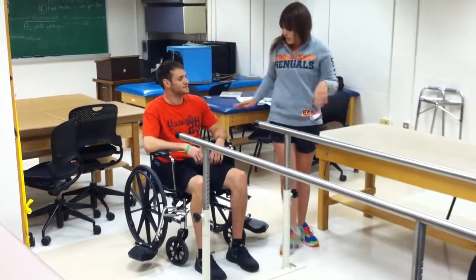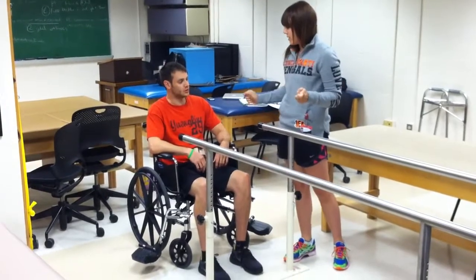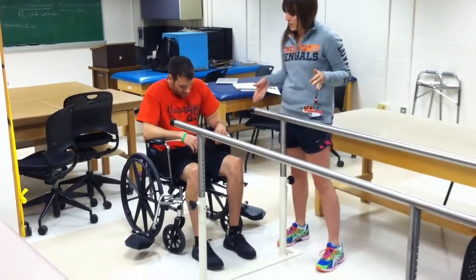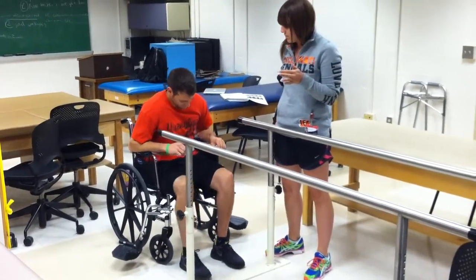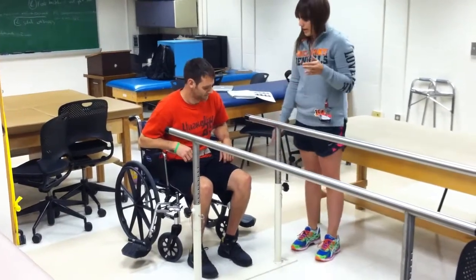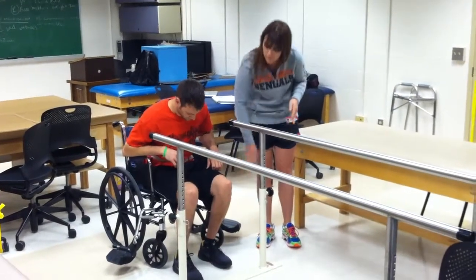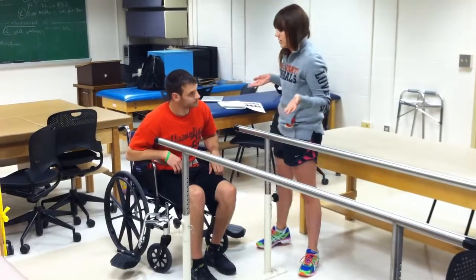What you're going to do is push up from your armrest on your wheelchair — don't pull up from the parallel bars. Before we do that, we need you to scoot forward on your wheelchair, alternating your hips. You want your stronger leg to be a little bit behind your weaker leg, so that it can push up from your good leg.